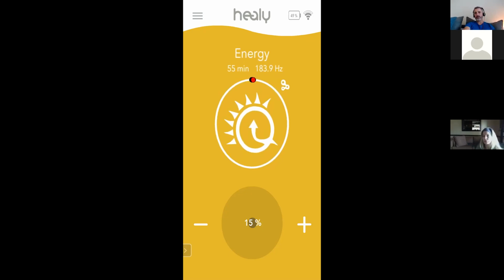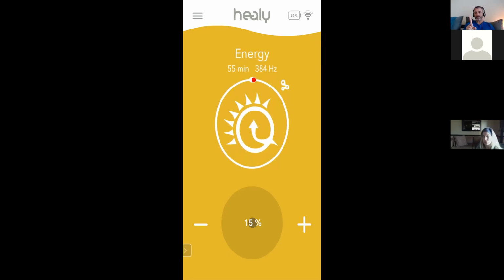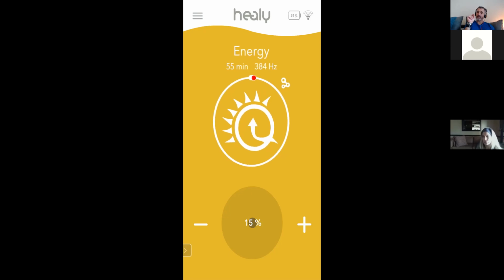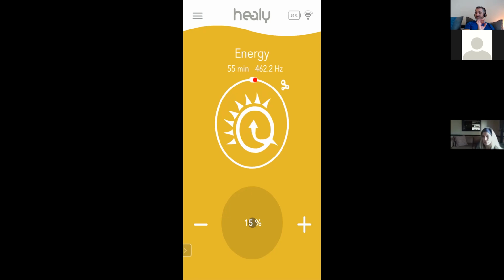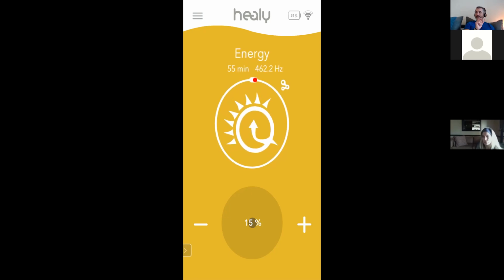So you notice this, it's going from white, and then it would go black occasionally, black to white, black to white. Now, I want to explain a little bit of that. If you pay attention, sometimes you'll notice it will go black when it gets very low frequency. And if it's just going black when it's low frequency, it doesn't necessarily mean you need to do anything. Sometimes the frequency is too low for it to measure a connectivity, okay?